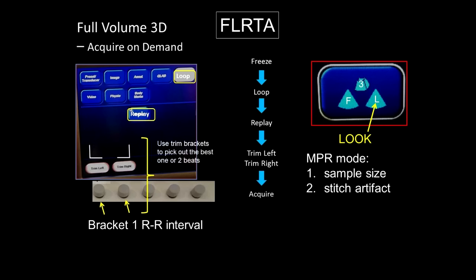Now we're talking about cropping modalities — the ways we dissect away echo data we don't want, to reveal the data we're most interested in. There are three cropping modalities: XYZ cropping, adjustable plane cropping, and iCrop — which is the newest. XYZ cropping places the heart in a yellow cube and we can crop from the front, back, top, bottom, right, and left — any or all of them. Whatever we crop away, we can put back too.